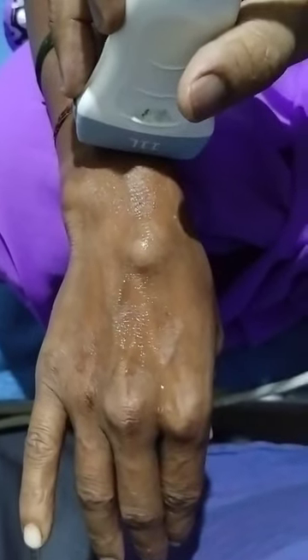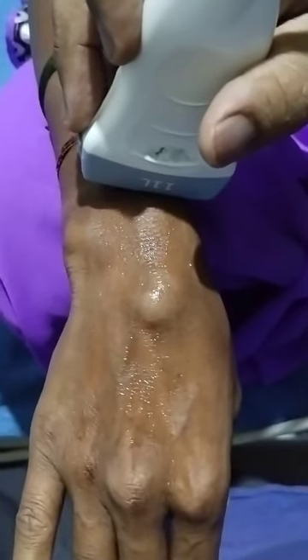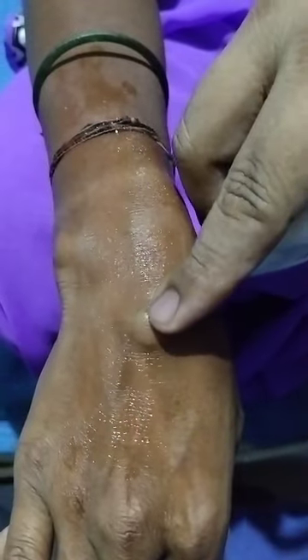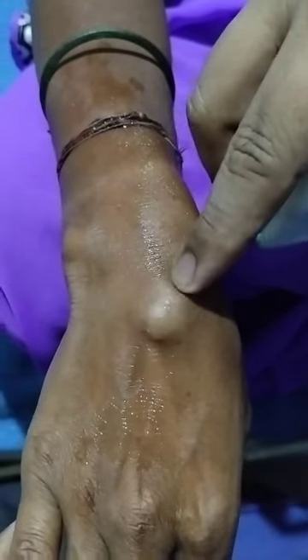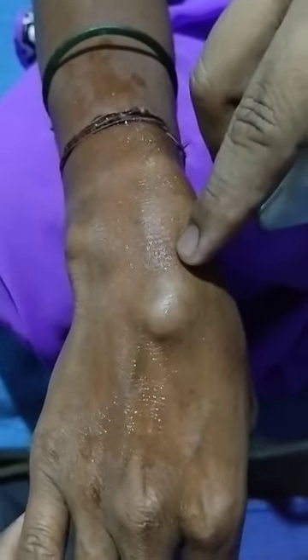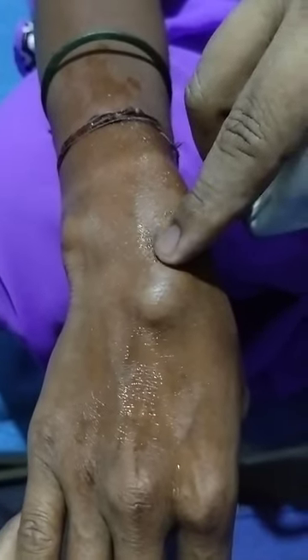Good afternoon. This is a swelling overlying the dorsal aspect of the hand and wrist. You can see the swelling here. Typically we will consider a ganglion cyst being there.